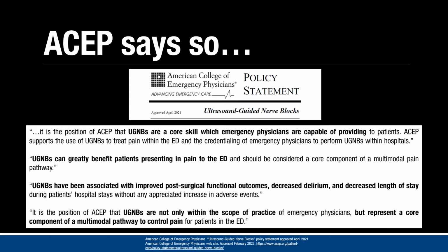And then this last statement is the censure for me. It's the position of ACEP that ultrasound-guided nerve blocks are not only within the scope of practice of emergency physicians, but represent a core component of a multimodal pathway to control pain. There are numerous reasons that ACEP highlights as to why we should be performing these blocks.